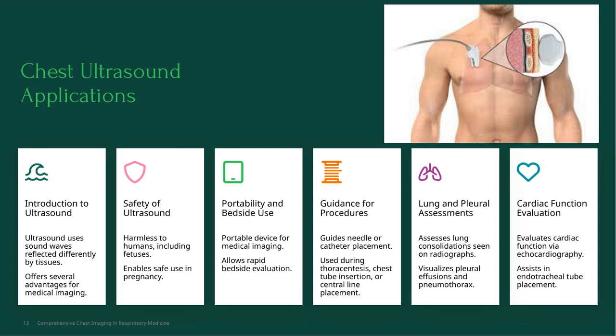Moving on to lung and pleural assessments. Ultrasound is excellent for evaluating lung consolidations that we might see on radiographs, and it can clearly visualize pleural effusions and pneumothorax, which are critical in respiratory emergencies.